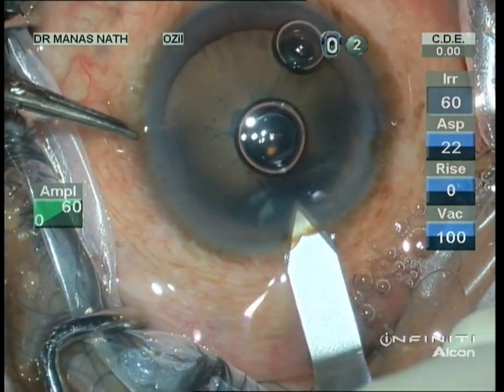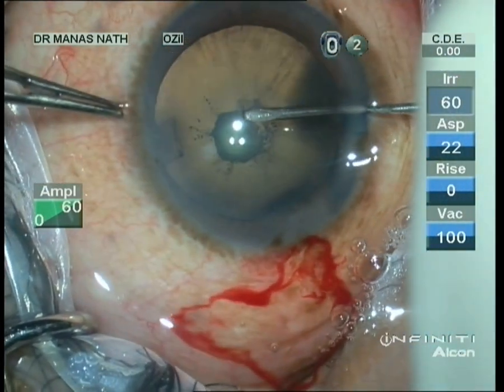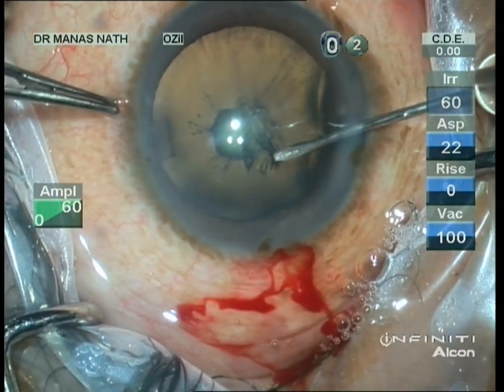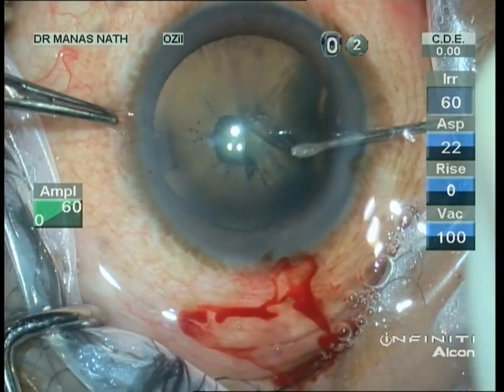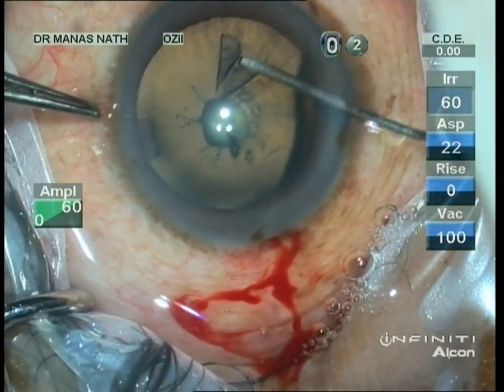So I have to be very careful — the posterior capsule can be thin or can be damaged in those locations. I'm planning to do a capsulorrhexis of around 4.5 to 5 millimeters.